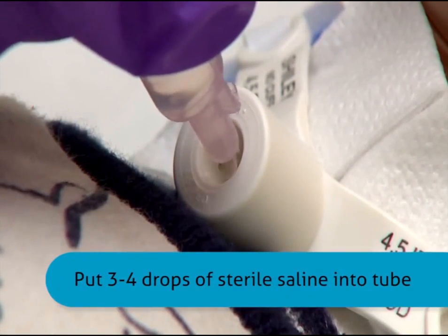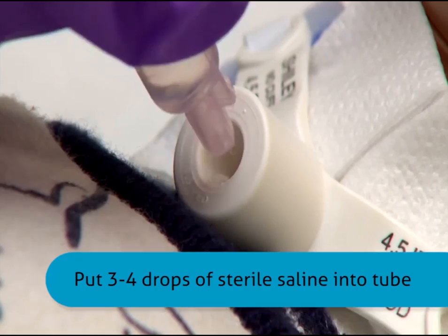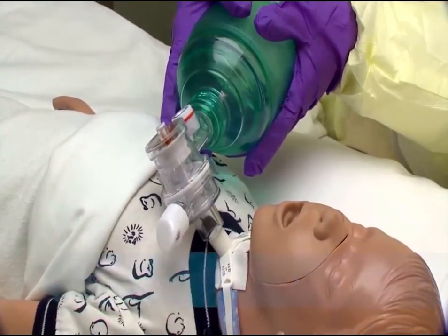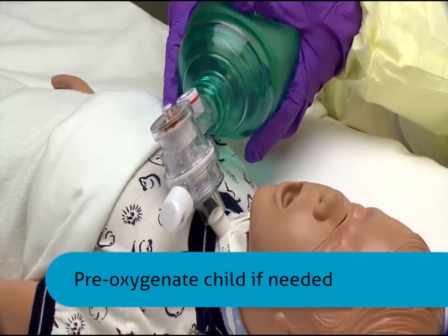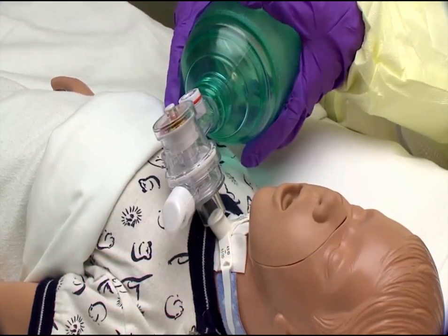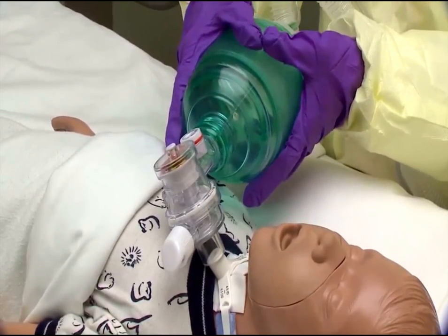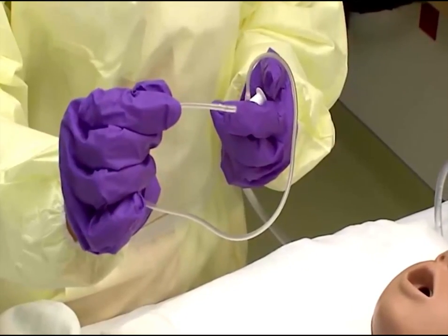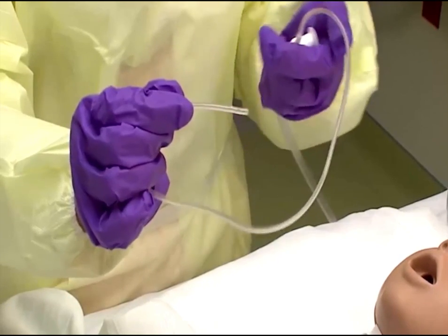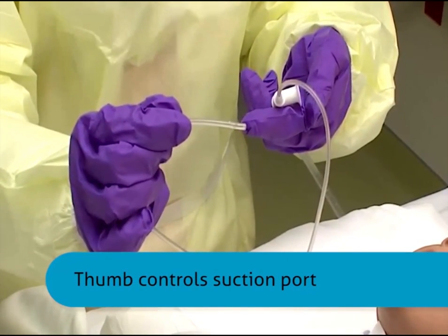Instill three to four drops of sterile saline into the tracheostomy tube. Pre-oxygenate the child if needed. Note that a child who is able to breathe deeply and cough may not need a manual resuscitation bag during suctioning. Using your sterile gloved dominant hand, pick up the catheter. The thumb of the opposite hand controls the suction port.